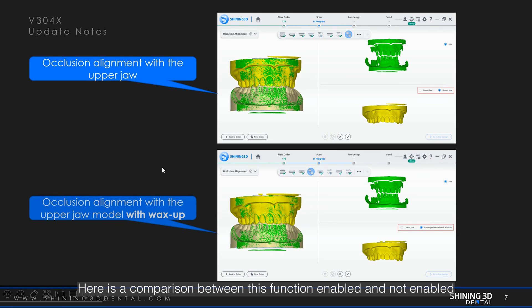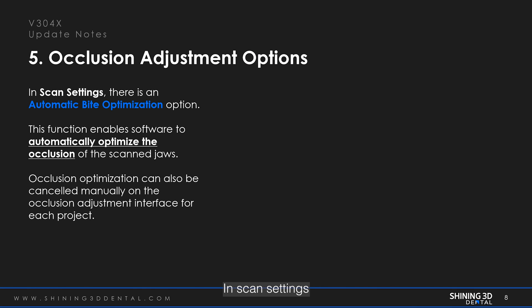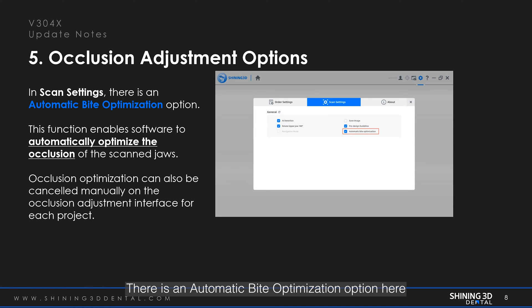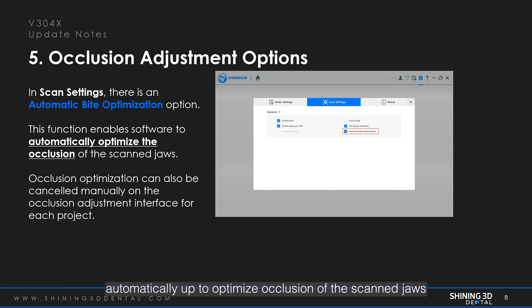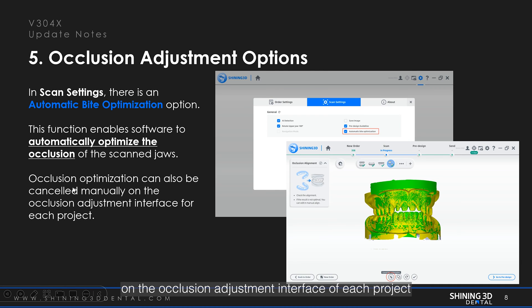Here is a comparison between this function enabled and not enabled. The fifth upgrade is occlusion adjustment options. In scan settings, there is an automatic bite optimization option. This function enables the software to automatically optimize the occlusion of the scanned jaws. However, if we don't want this automatic optimization for the occlusion, we can cancel this function manually on the occlusion adjustment interface of each project.